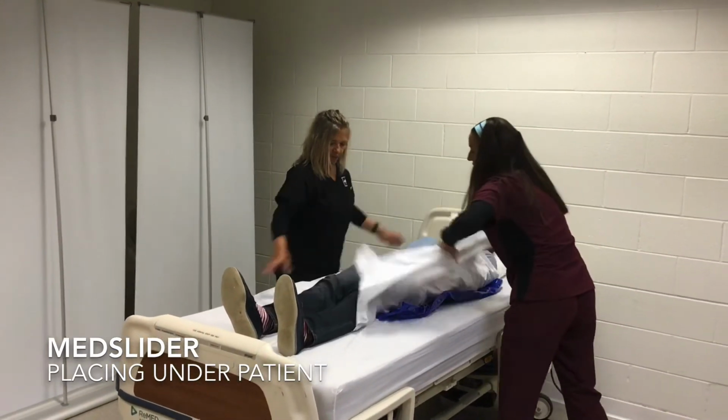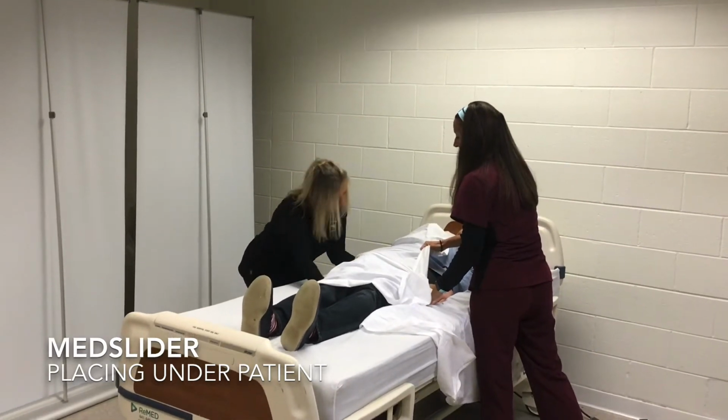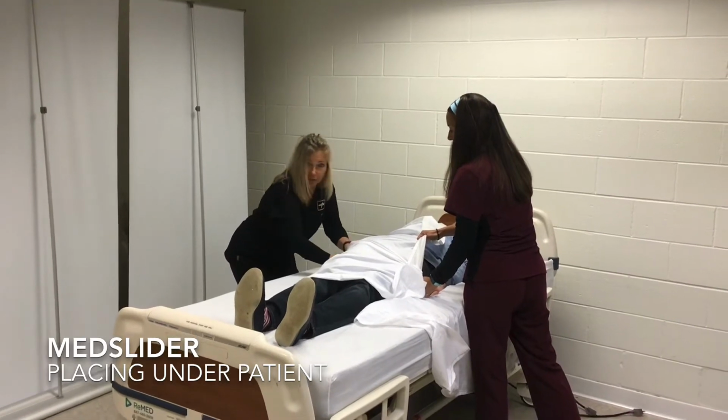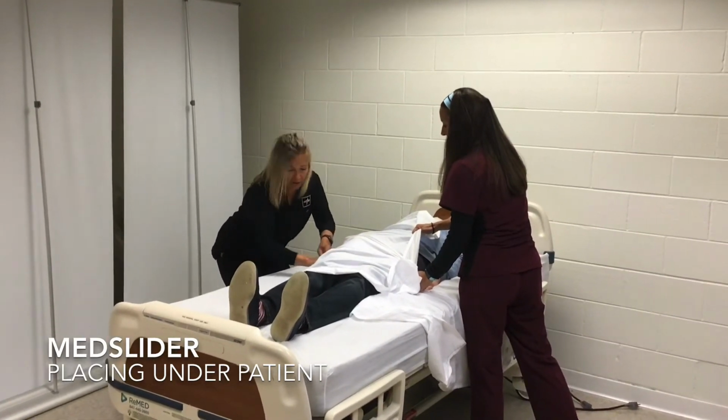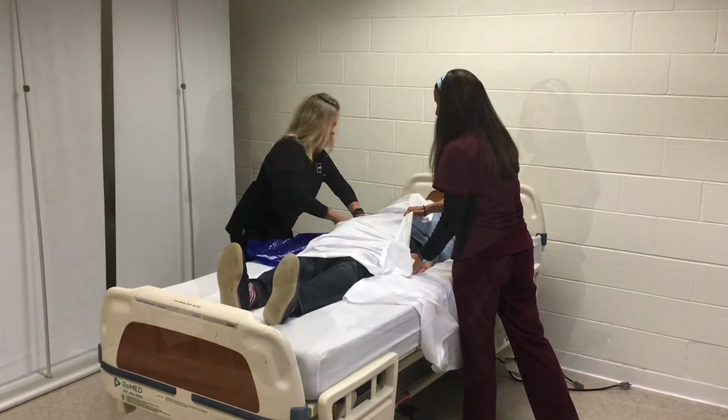And now she will lift, just go under and find the slider, which is right here, and then I simply pull through on the other side. Super easy, in case you can't log roll that patient.